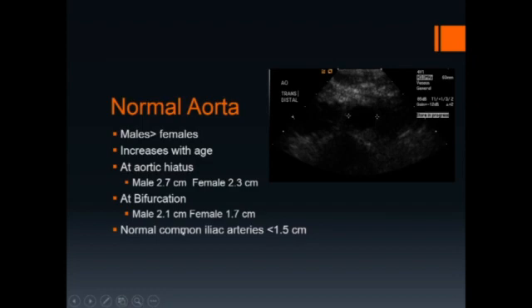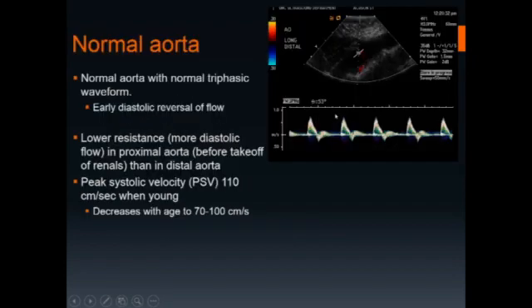The normal common iliac artery should be less than 1.5 cm in size. This image shows the appropriate way to measure the aorta in the transverse plane. The Doppler waveform of the normal aorta is triphasic with early diastolic reversal of flow. Lower resistance, i.e. more diastolic flow, is seen in the proximal aorta before the takeoff of the renal arteries than in the distal aorta. Peak systolic velocity in the normal aorta is 110 cm per second when young, decreasing to 70–100 cm per second with increasing age.